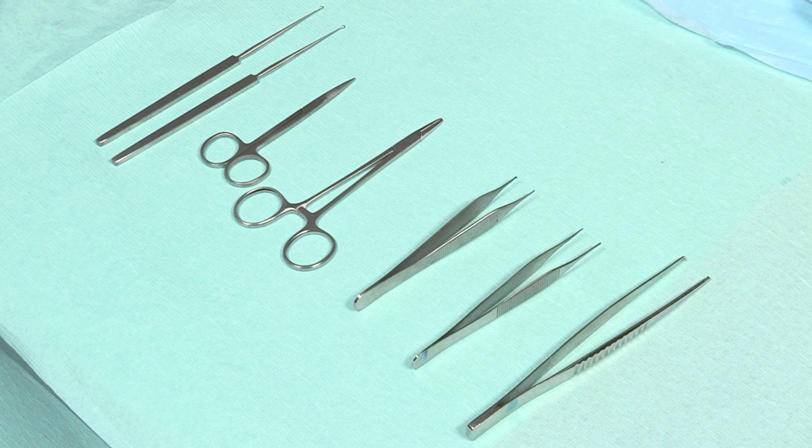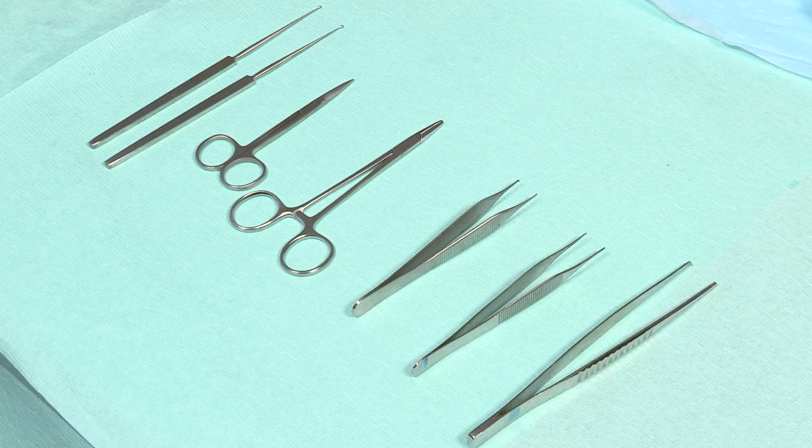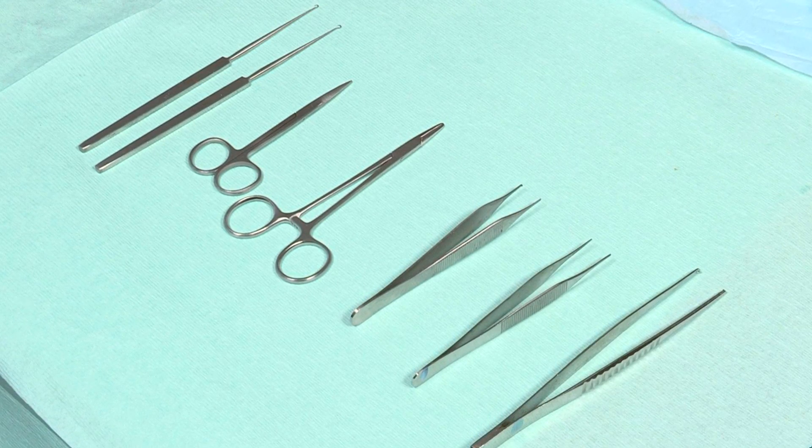The instruments you'll need for suturing the skin are forceps, suture scissors, a needle holder, and skin hooks or retractors depending on where you are operating.